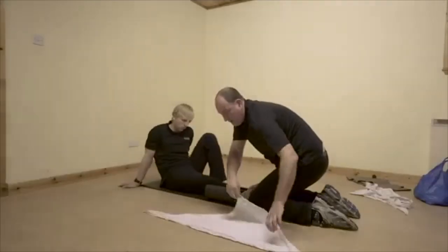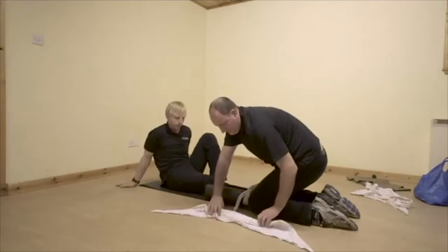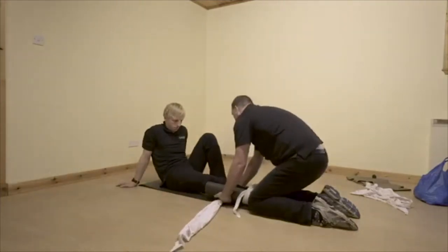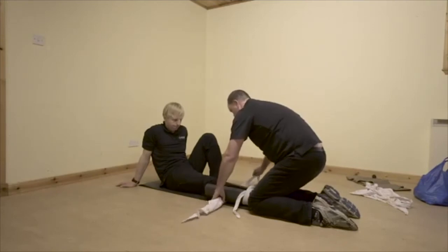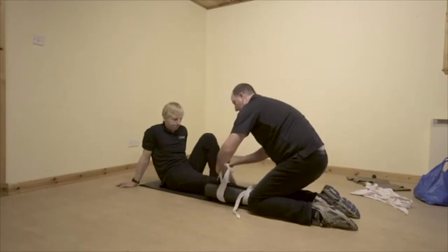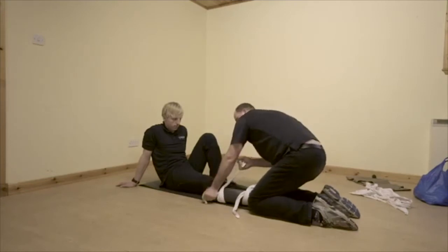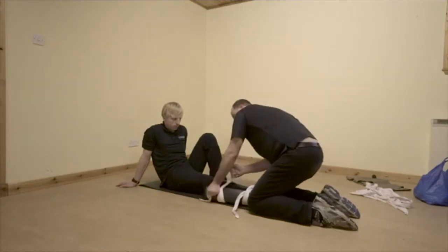I've got another one here. Do the same thing but higher up, nearer to the knee. Let's slide it underneath very gently. Doing a great job, Casualty. And again we're going to tie it - double bow - and then we're just going to really give that some pressure and really tighten this up.